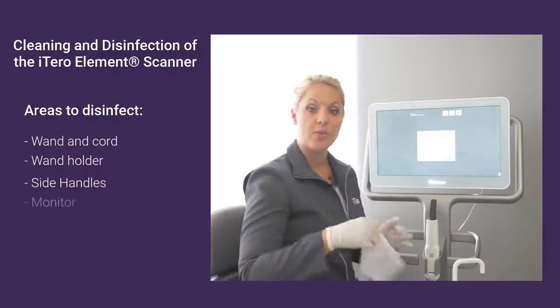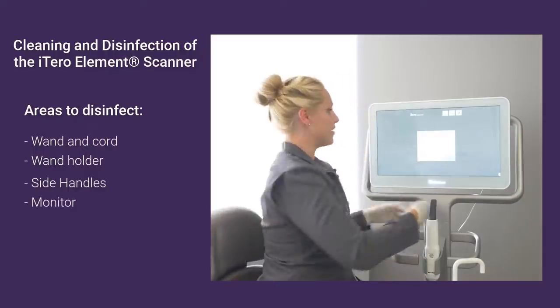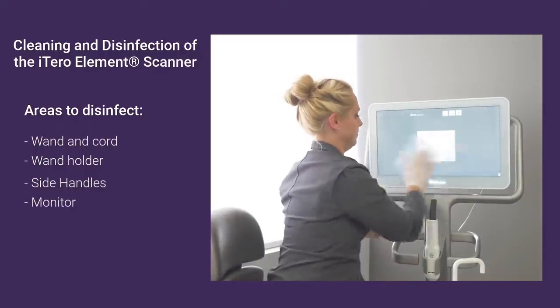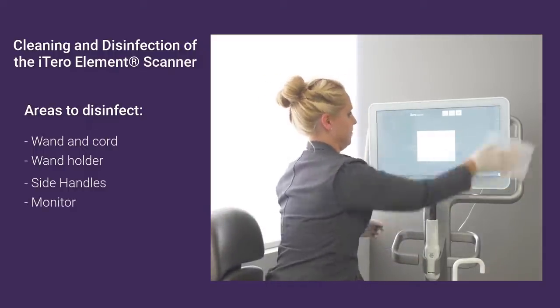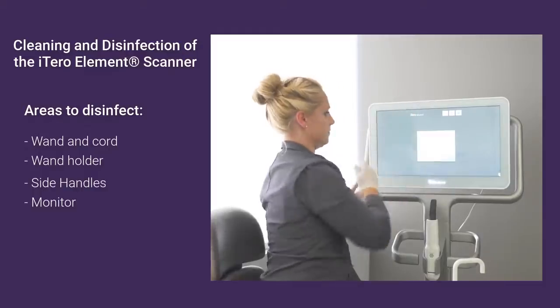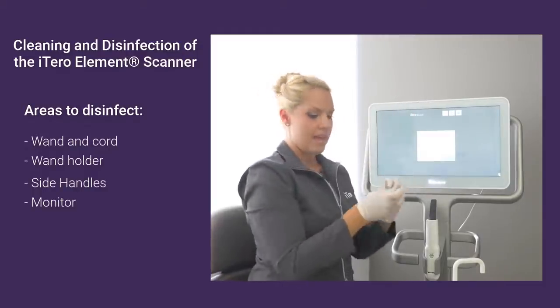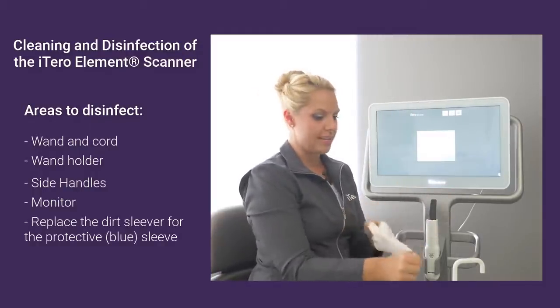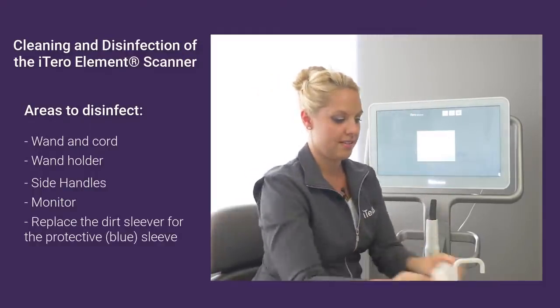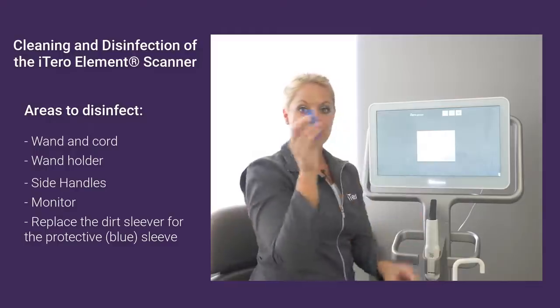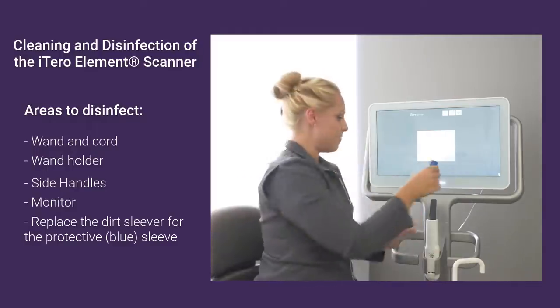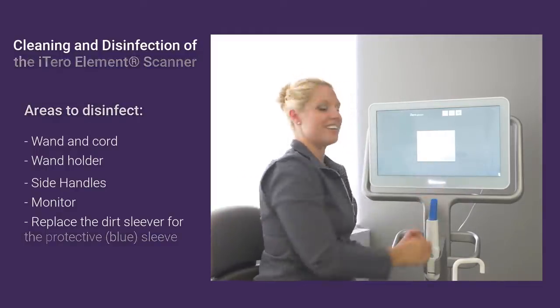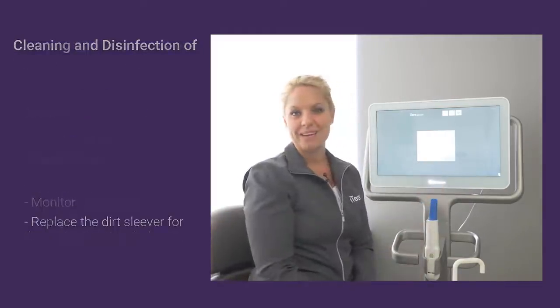In addition, I'm also going to wipe down my monitor. And then last, I'm going to replace my blue protective sleeve back on the wand until I'm ready to start scanning again.